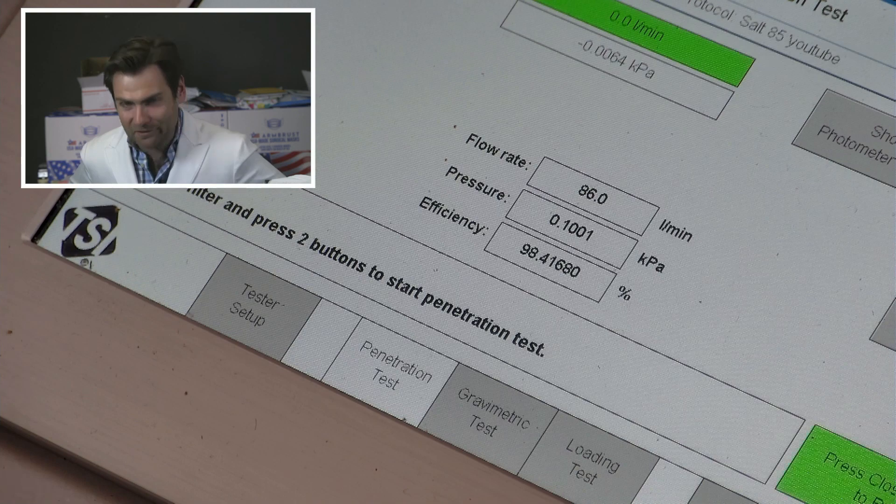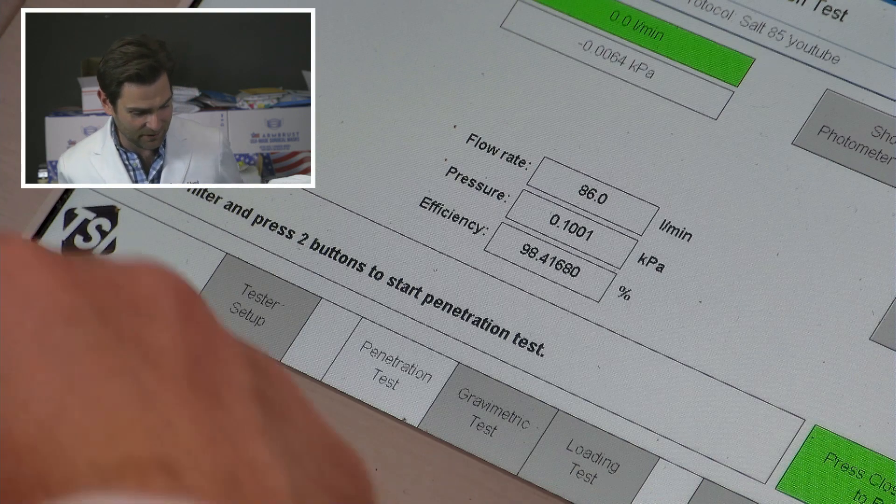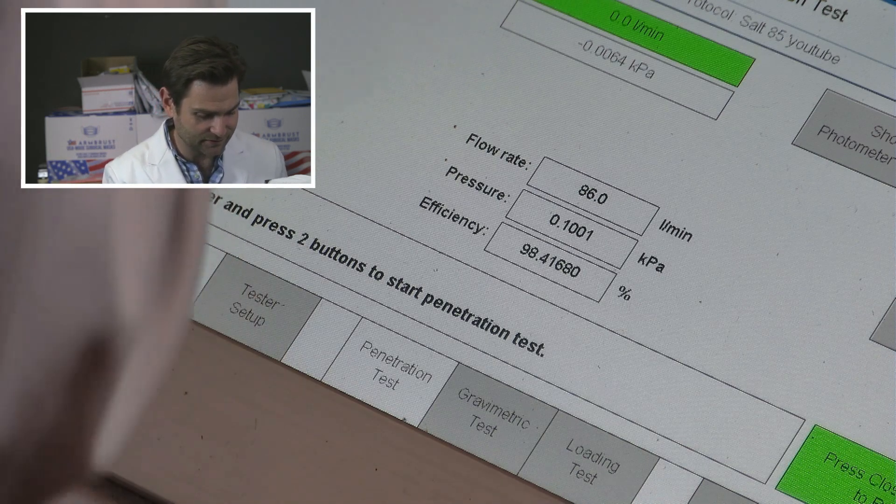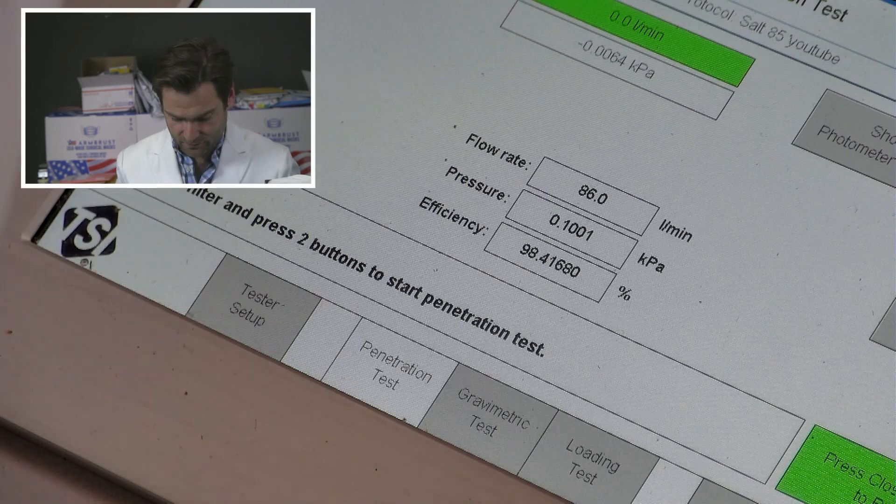98.41. Oh, I wanted to fail. I wanted to fail today. I wanted to fail. This does look sketchy. It's like weirdly see-through. It says N95. It's not N95. But 98.41 at 100.1 Pascals.